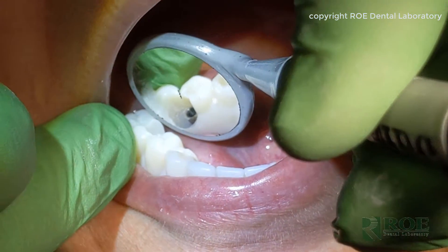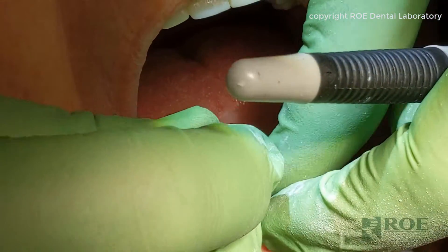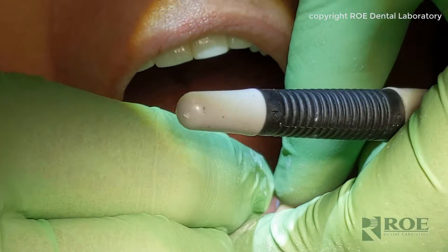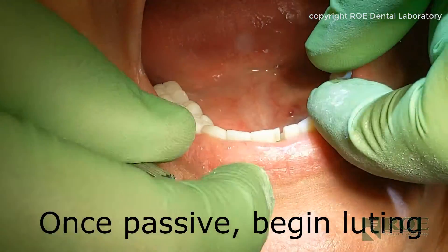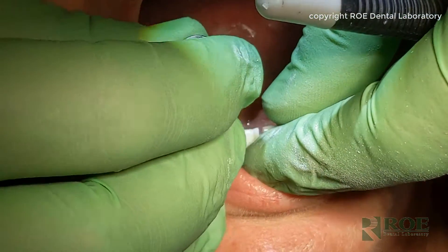One of the tricks is to make sure where they are meeting is that they're kind of squared off — you can see they're kind of squared off in the interior. That's the right spot. All the temporary cylinders are down.